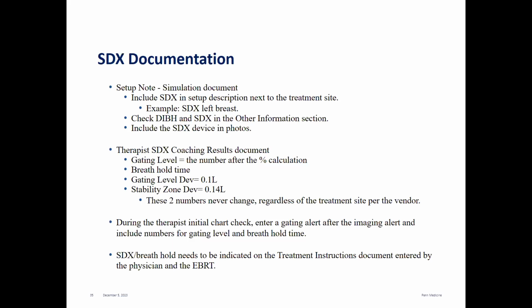During the therapist's initial chart check, the therapist will enter a gating alert. So this will pop up on the treatment console when the patient first comes for treatment. You want to make sure that you put the gating level in there and the breath hold time that they can hold their breath. Then this is where you would also check to make sure that it pulls up correctly in the system. SDX breath hold needs to be indicated also by a physician. They put this in their treatment instructions and they also put it in their EBRT.